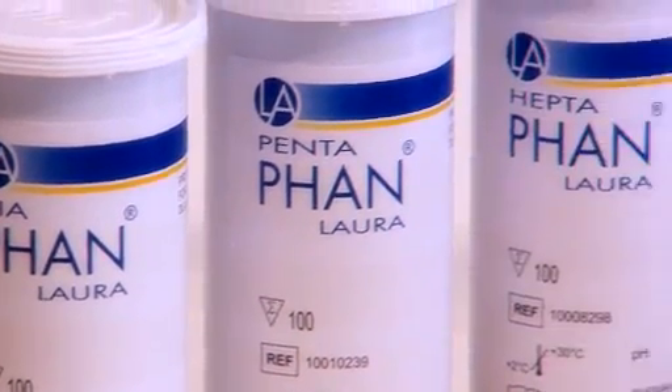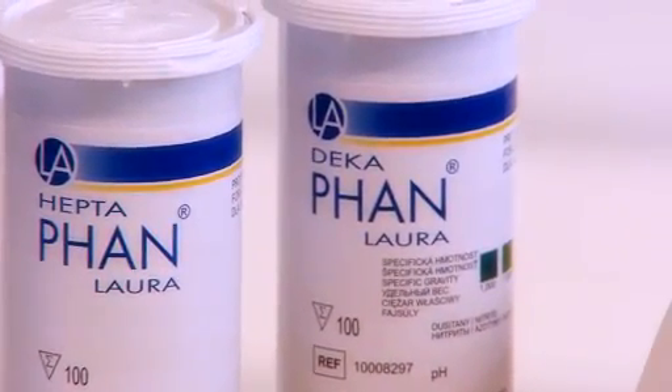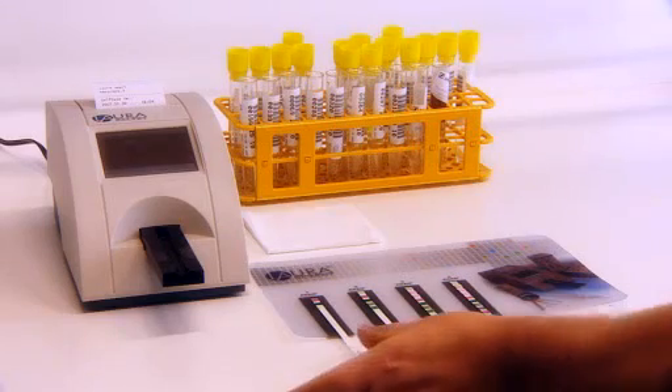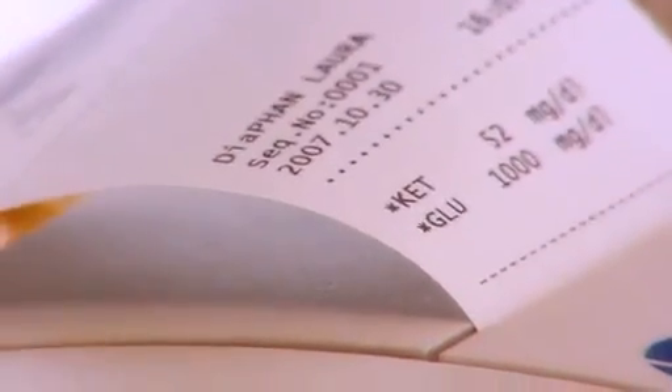The LAURA Smart reader can automatically distinguish the type of diagnostic strip used. There are four types of diagnostic strip with two to ten parameters. The advantage of the PHAN LAURA is the compensation field, which allows the reader to take into account the colouring of the urine in the results of the individual parameters.